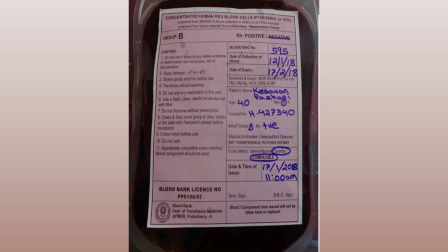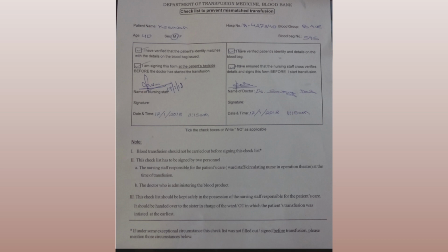And also look into the medical order of the patient as to any special instructions that have been given with respect to how to transfuse blood, what is the rate to be followed, or any necessary precautions to be taken up. And also, if applicable, make a note of the expiration date and time, if at all written on the blood products. So that is the checklist that has been shown, which has to be ideally signed by two different people before starting the transfusion to make sure that the correct product is being transfused to the correct patient.